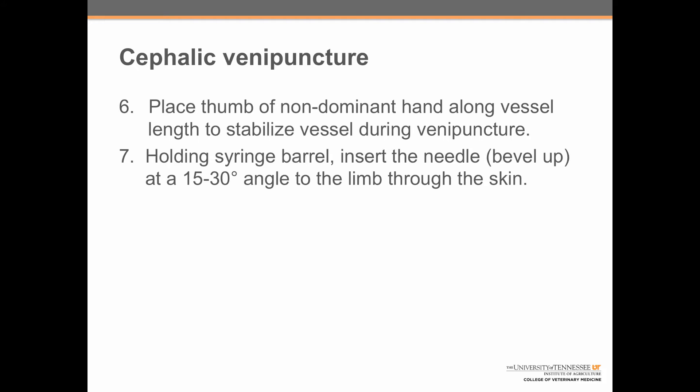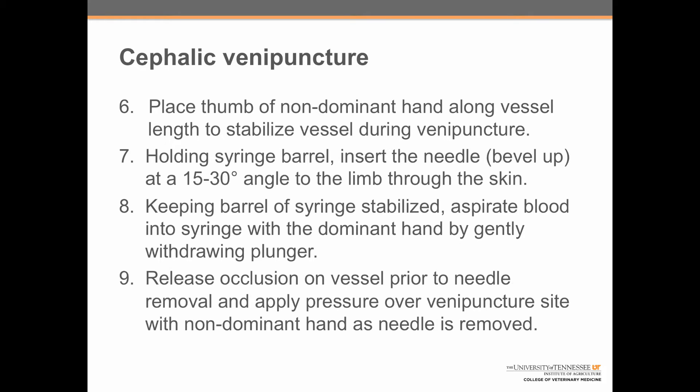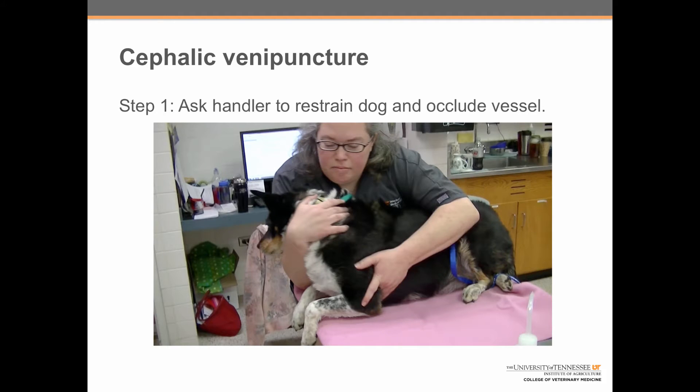The bevel refers to the angled edge of the needle. Step eight: keeping the barrel of the syringe stabilized, aspirate blood into the syringe with the dominant hand by gently withdrawing the plunger. Step nine: release occlusion on the vessel prior to needle removal and apply pressure over the venipuncture site with the non-dominant hand as the needle is removed. Let's go through these steps individually.